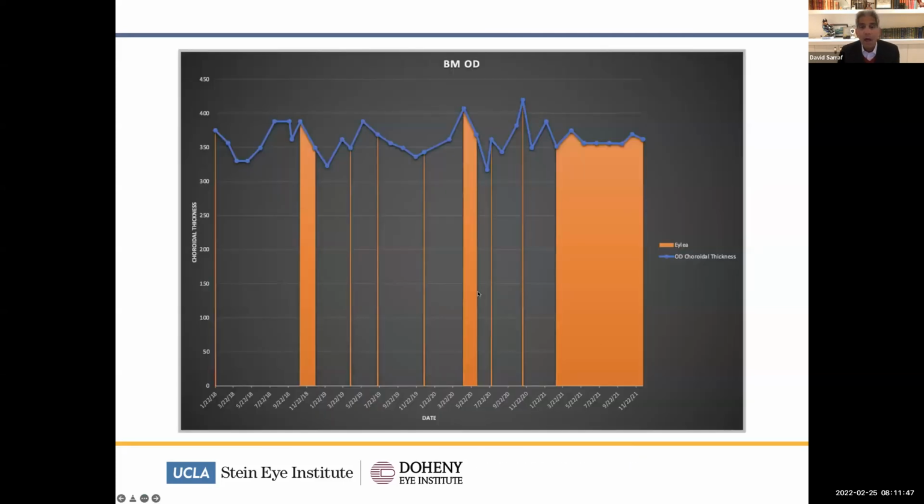And then again, the graph that our fellows put together showing you a commensurate reduction in the choroid, indicating that the choroid is driving fluid. When we reduce the choroid with Eylea injections, we reduce choroidal thickening and we resolve the peripapillary intraretinal and subretinal fluid that was occurring in the more severe cases. And this was critical because, as I say, this patient was developing ellipsoid loss associated with that chronic intraretinal fluid.